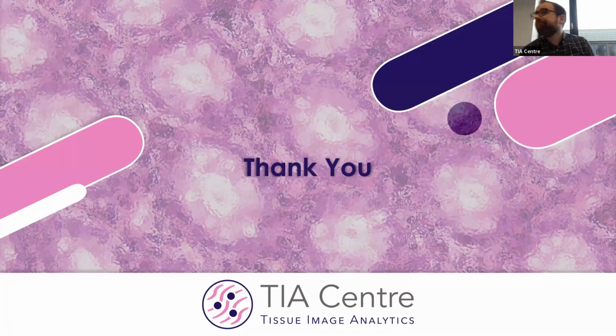Mark, is there the ability to annotate some region that you want the pathologist to see? For example, some cells the classifier is not definite about, and you want the pathologist to comment on them, so you can share. So you can potentially, if you set up an online demo, just share a link to that region, saying there's some dodgy model behavior in this region, what do you think? So yes, you could do that sort of thing.